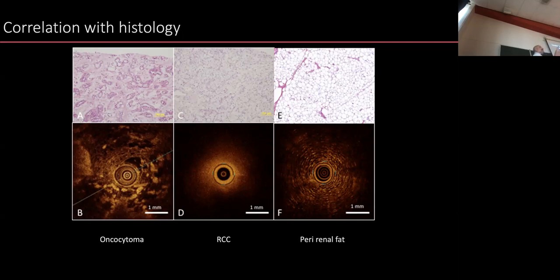And you don't want these tumor cells to be invasive in the perirenal fat. The perirenal fat has this classical honeycomb structure that we can see very well in OCT. And we hope, of course, that we don't have these malignant clusters in there. So these three types of tissue we want to differentiate to come up with the diagnosis.